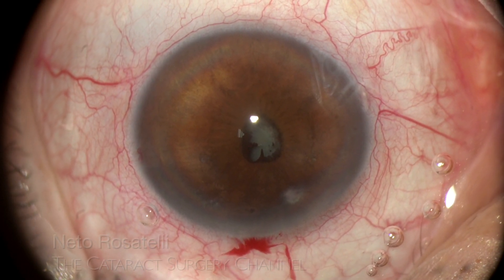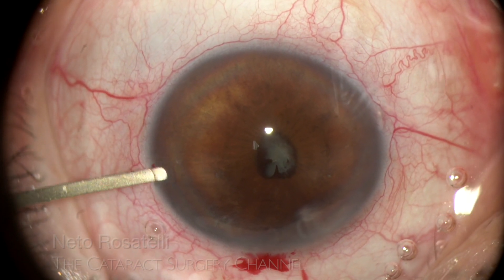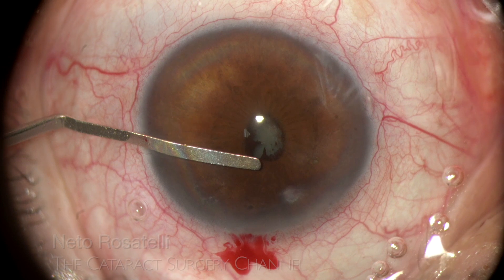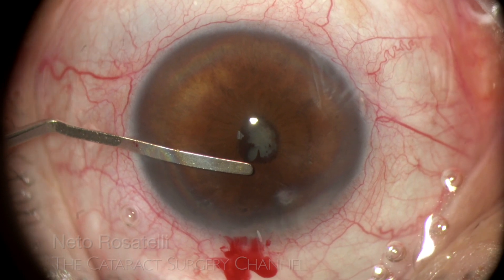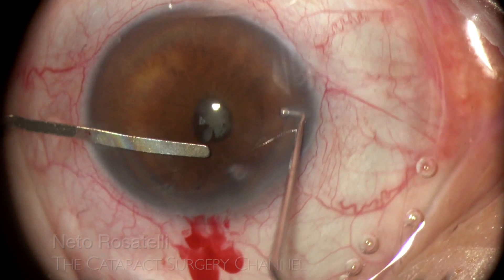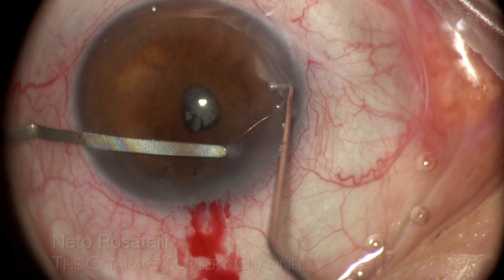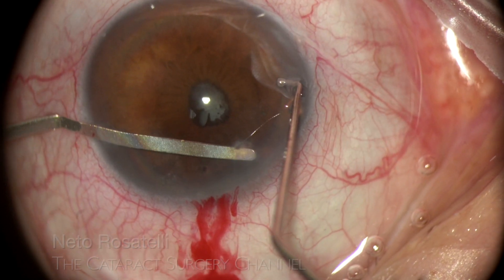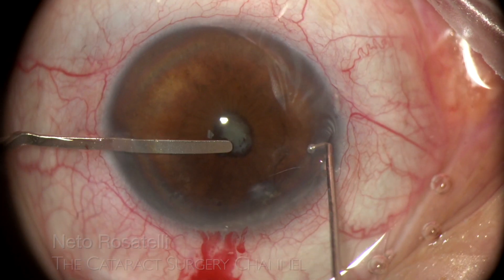First task is to liberate the pupil, and a thin spatula will be used for that. It is most important to completely liberate any pupillary adhesion in order to be able to safely use the pupil expander device, and also end up with a nice round and once again functional pupil. A second instrument helps holding the eye, and the spatula is used to carefully break the peripheral anterior synechia, without damaging the iris or the corneal endothelium. No corneal touch here.